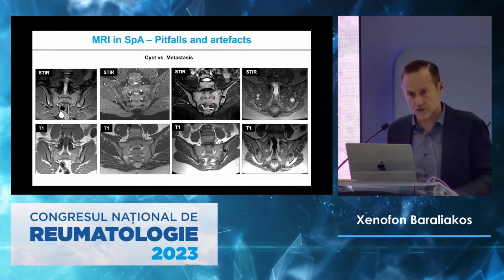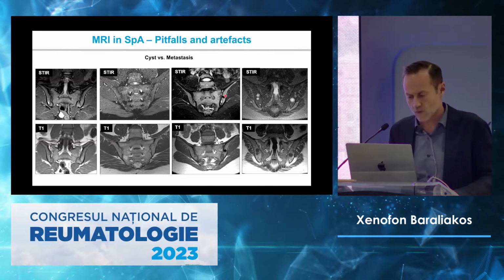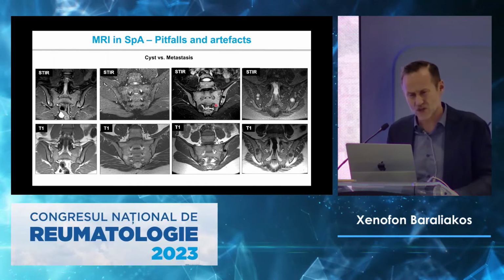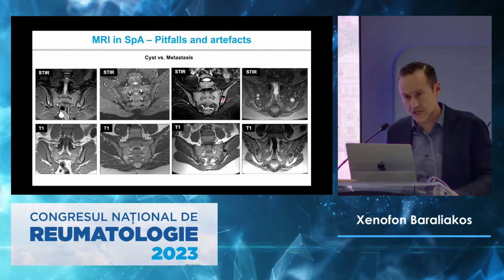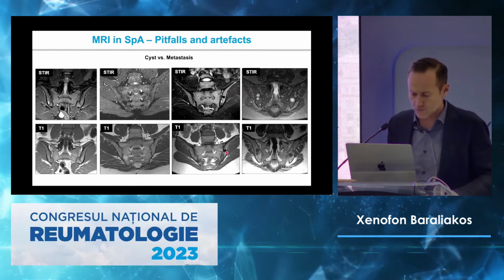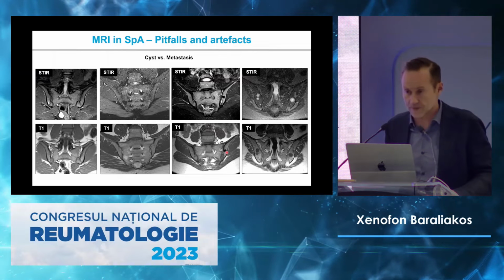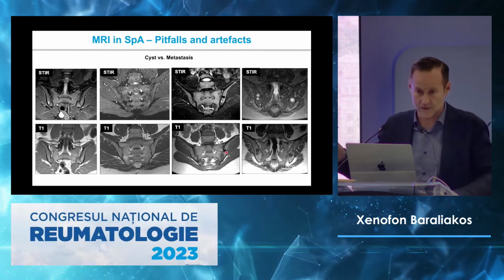The third patient, let's move over, has also one single such lesion. It's in the middle of the joint, unfortunately, and it's also very close to it, but it's also very round-shaped. It's not the way I showed you that the lesions may look like. They go from the top to the bottom, and it's also black on T1. That's also a cyst. It's empty. One round-shaped thing doesn't do anything.